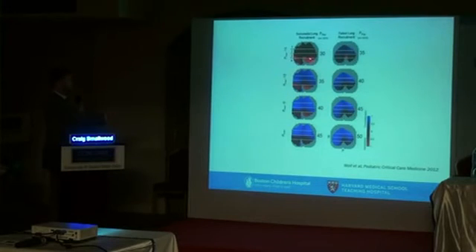You can see that the red here is our coloration of alveolar collapse. And you can see there's a lot of collapse here and not a whole lot of overdistension. In a patient who failed the lung recruitment at their Pmax, basically this would be like baseline ventilation, that's what this phase is. There's not a whole lot of collapse. A little bit of overdistension, but really just not a problem. And I think that's what we found, is they just didn't have a whole lot of recruitable alveoli.